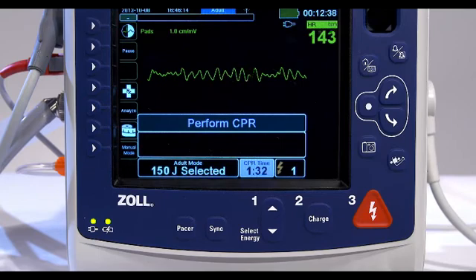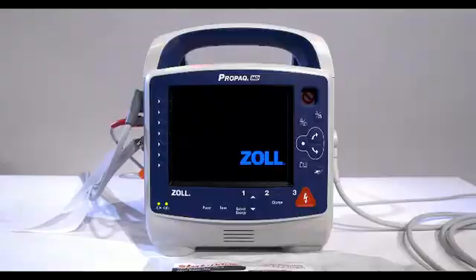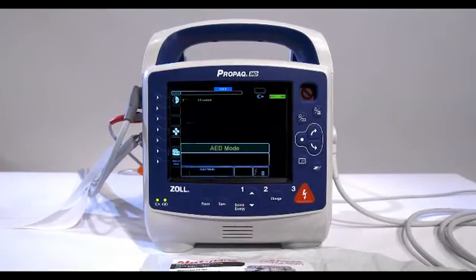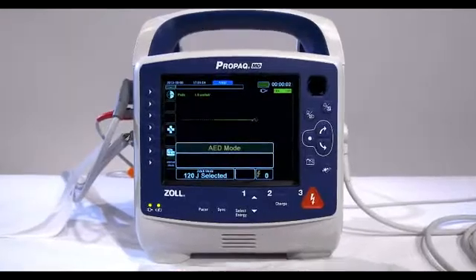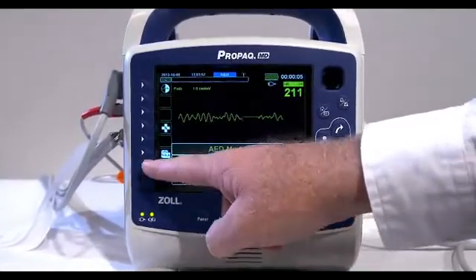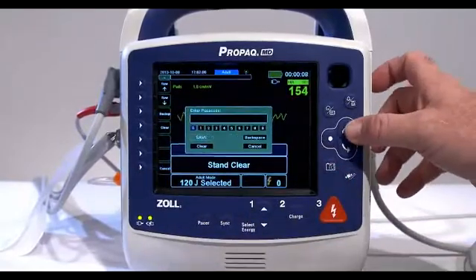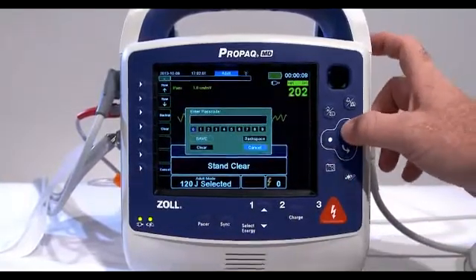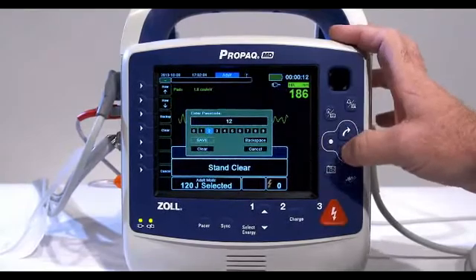If at any time you want to cancel the defibrillation, press the pause soft key. To switch from AED mode to manual mode, press the manual mode quick access key on the front panel of the unit. Using the navigation keys, select the four digits in the manual mode passcode and press save when you are finished.